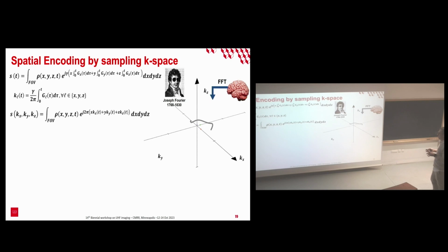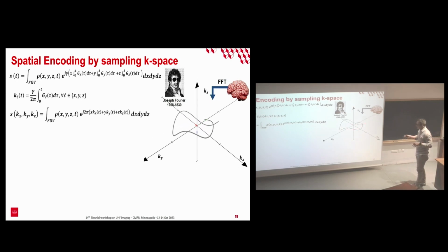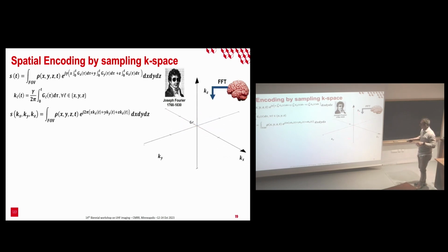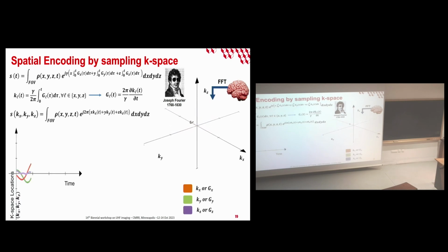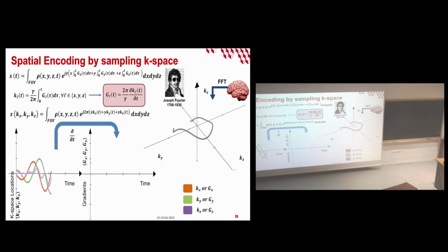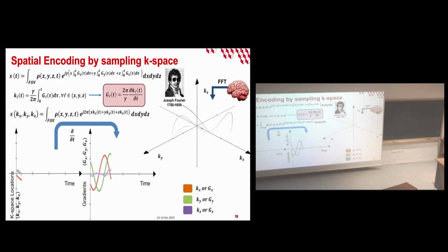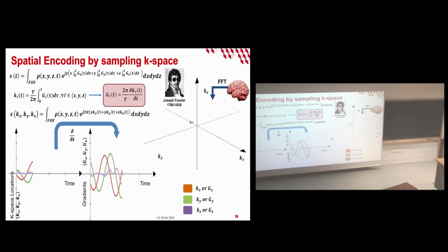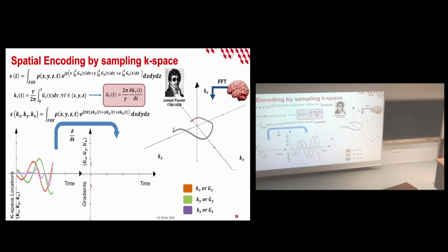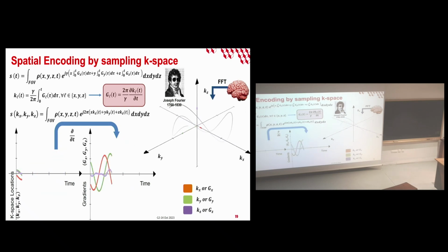So here is an illustration of what's happening. This is what we call the k-space, represented in 3D with kx, ky, and kz, showing you how to navigate in this spatial frequency domain during the acquisition. You have a one-to-one mapping between this k-space and its temporal derivatives, the gradients, which in practice you manipulate in your pulse sequence to tell the MR system how to collect the data.